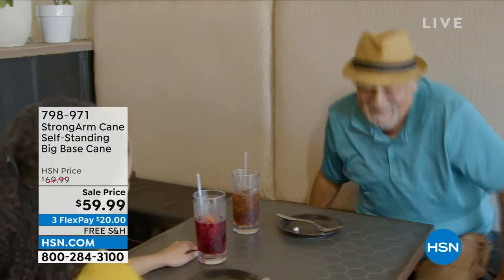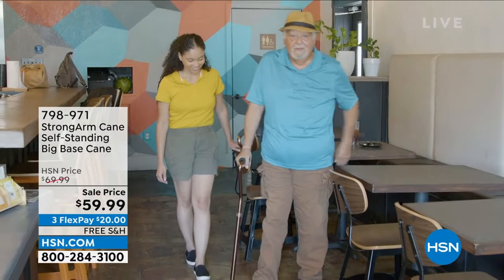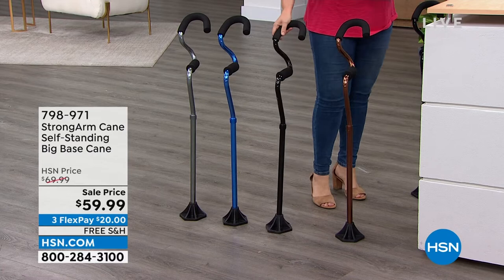This is already five-star rated, 500-pound capacity. We've got less than 2,000 of these available, so $10 savings today. We do have three flex pay — only have to pay the first $20 to get yours home. We've got it in a couple of colors: titanium, a really cool race car blue, black, and bronze.